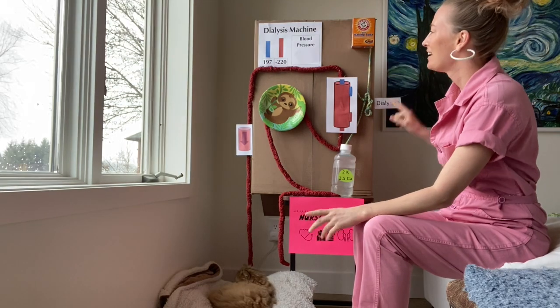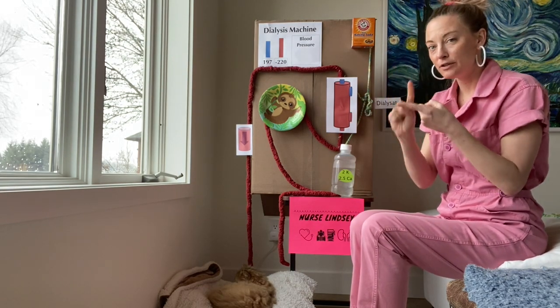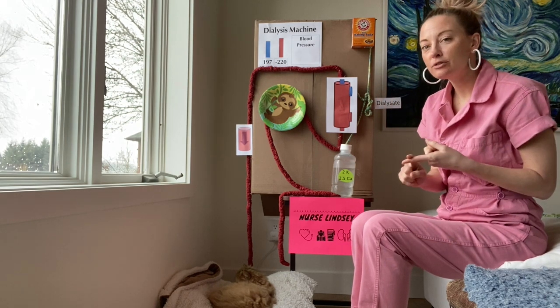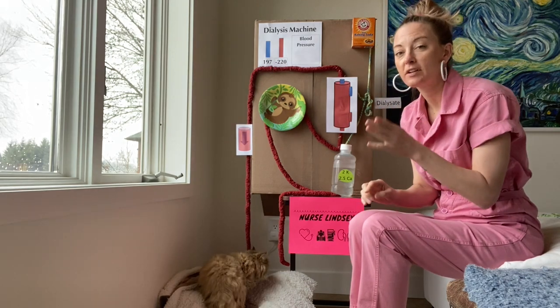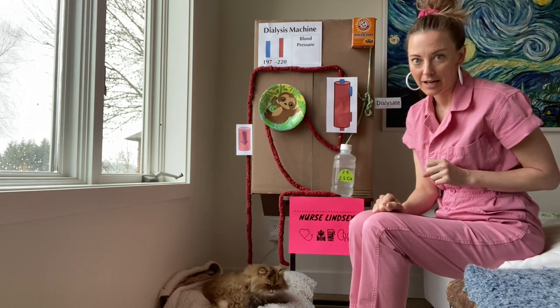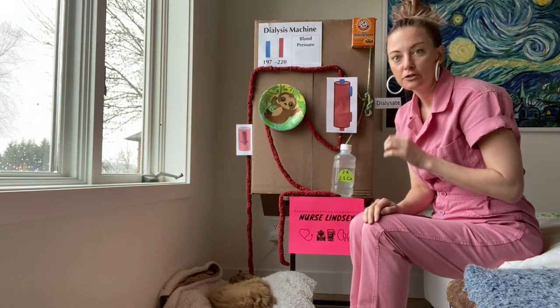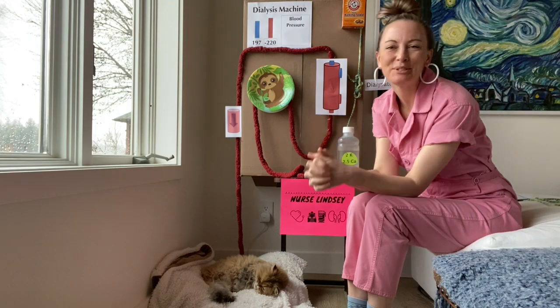The dialysis machine pretty much works in two ways: it uses diffusion and it uses ultrafiltration. It uses diffusion to clean the blood, correct electrolytes — specifically bring that potassium down, because we all know high potassium causes cardiac death — and correct acid-base balance. Then it uses ultrafiltration to remove extra fluid from the patient.